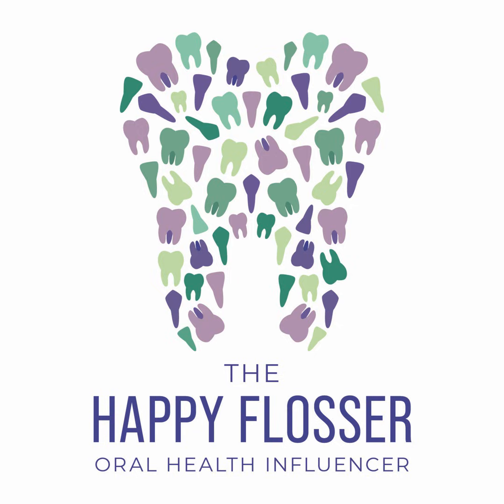These things are less dense on a radiographic image, so it's important for you to know what the normal limits are of those items. So the alveolar crest in health, we look at the level of the alveolar bone, and the alveolar bone in a healthy patient should be about 2 millimeters apical to the CEJ. And this is one indicator that should be evaluated and noted when you are evaluating your patient. And then what is the contour of the alveolar bone? What is the horizontal contour and the vertical contour?